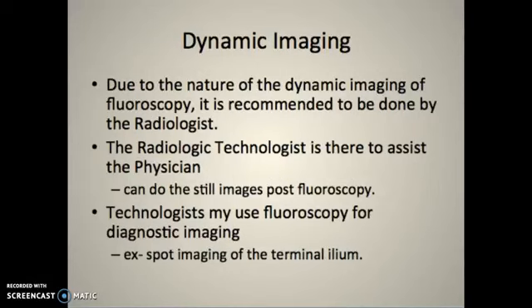Due to the nature of dynamic imaging, it is recommended that it's done by a radiologist. Technologists typically do not do fluoroscopy. You can have a PA, an NP, or an RA do fluoroscopy. There are some instances where we will do fluoroscopy, and it's usually for something like the terminal ileum.